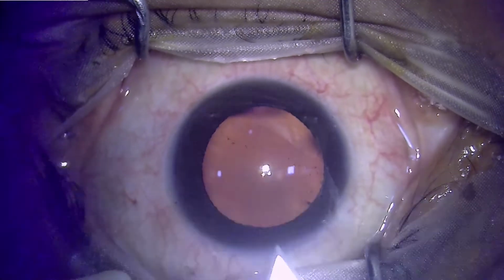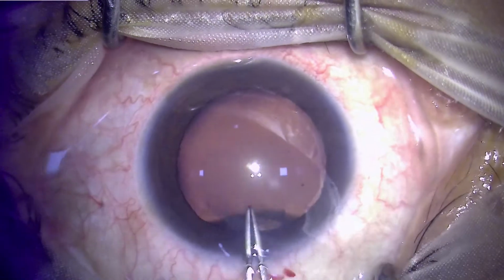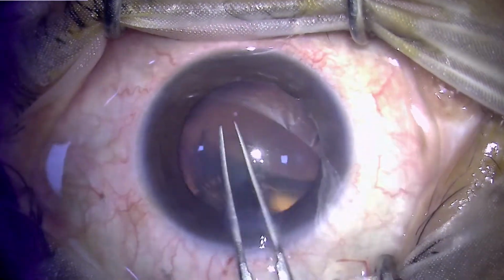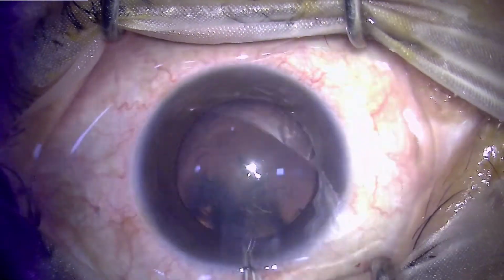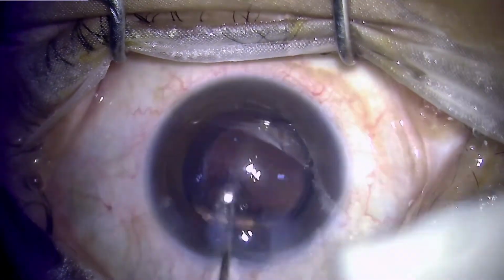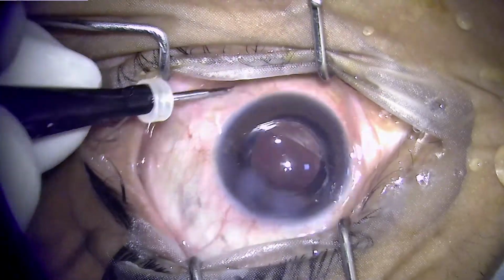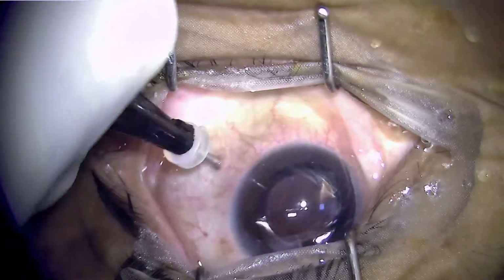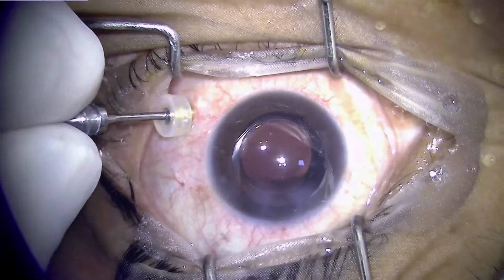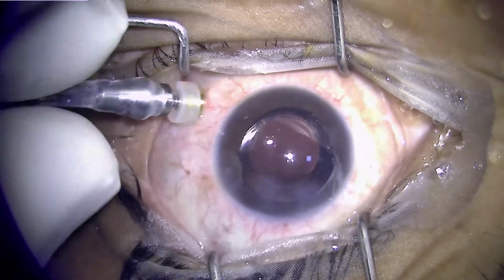So this was a surgery in which, if the patient is phakic, we usually combine it with cataract surgery, because invariably the installation of gas in the vitreous cavity will cause cataract formation. The cataract surgery has been done with implantation of a foldable posterior chamber IOL, and now we are proceeding for pars plana vitrectomy. So placing the trocars through a transconjunctival route.